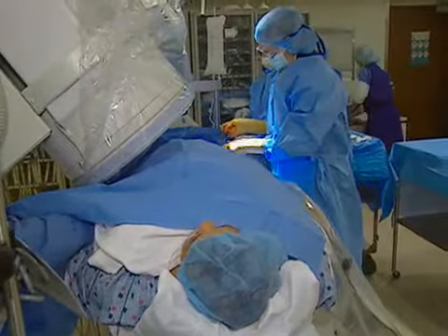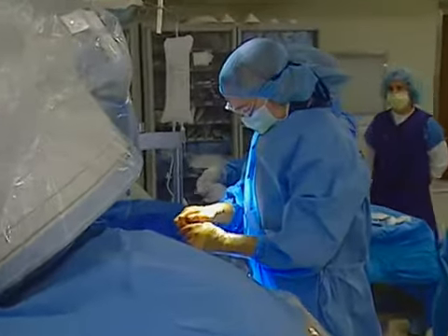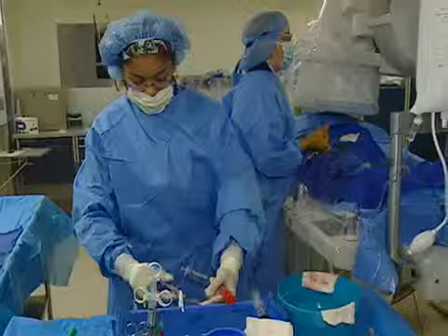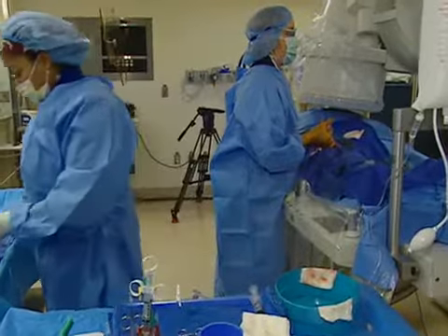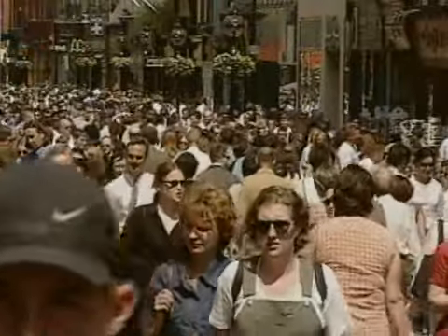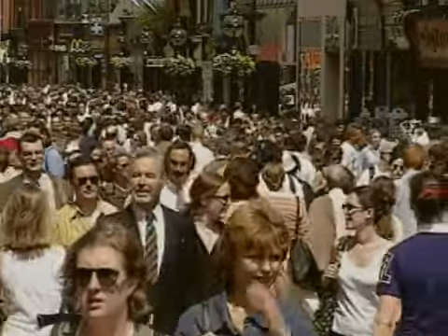Tiny beads are then injected via the catheter into the blood vessels that feed the fibroids. Over time, the lack of nourishing blood causes the fibroids to shrink, resulting in a dramatic reduction of common fibroid symptoms. UFE is not recommended for women who are pregnant or who wish to get pregnant.